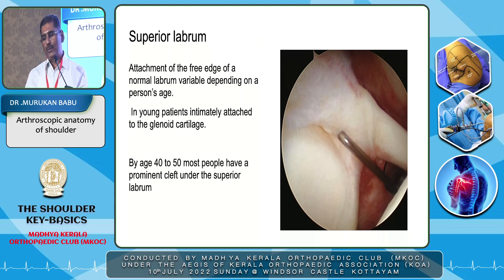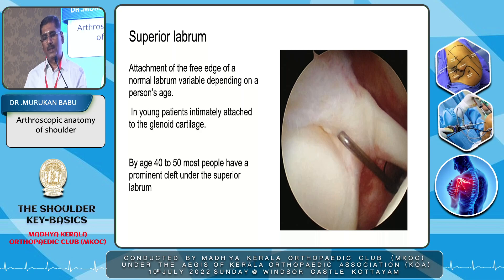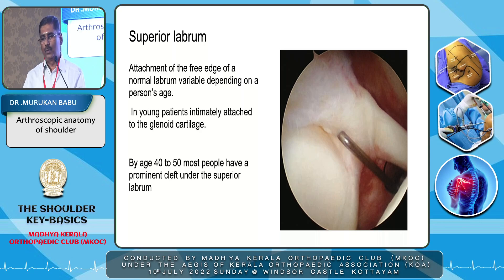The next part of the first position is the superior labrum. This is the attachment of the free edge of the normal labrum, which is variable depending on the patient's age. In young patients, it is intimately attached, but as age advances, there can be a cleft between the superior labrum and the glenoid, and that is also normal.